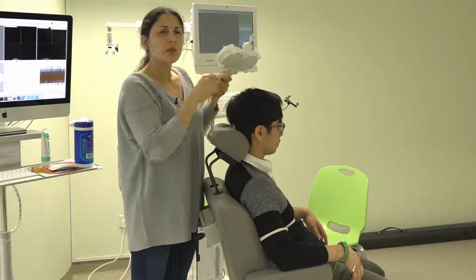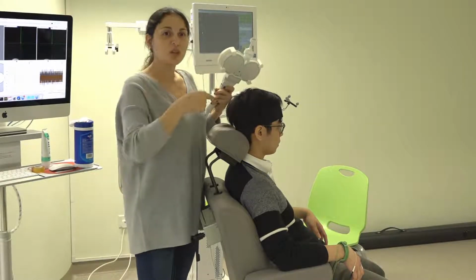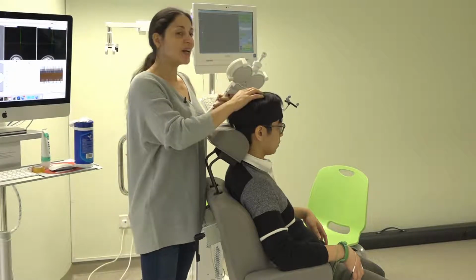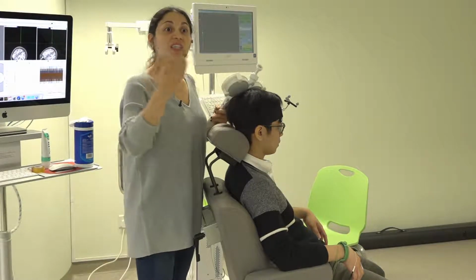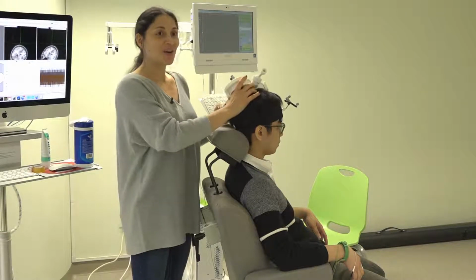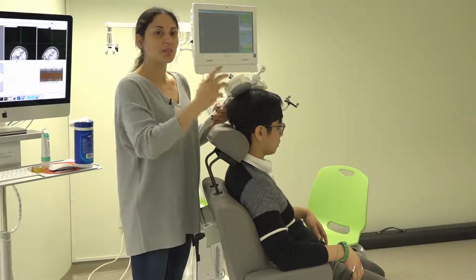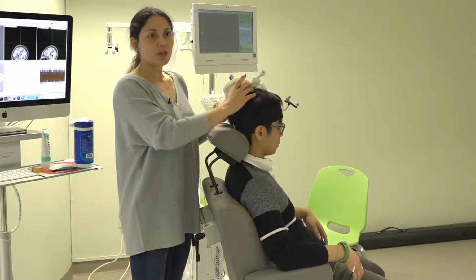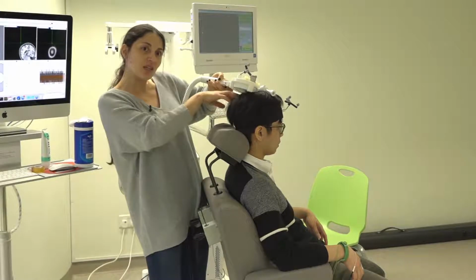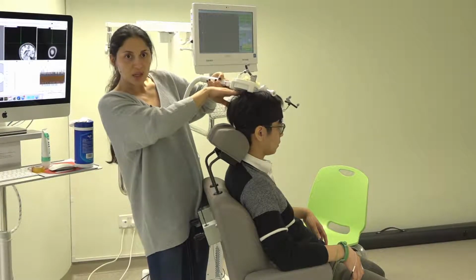Clear? Maybe you don't say it so much. When you are doing it tomorrow, I will correct you and say, no, that's wrong. And you need to have a feeling for it. When you are doing EEG, that's really hard because you need to keep the coil steady so that it doesn't damage the electrodes. And then the person has the tendency to move like this. Can you see?